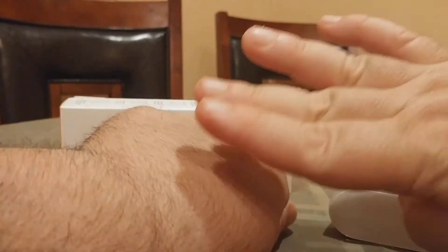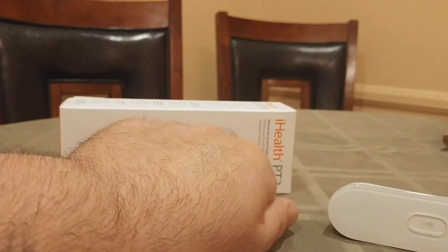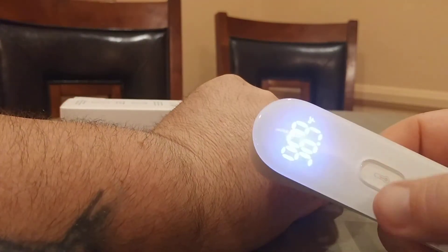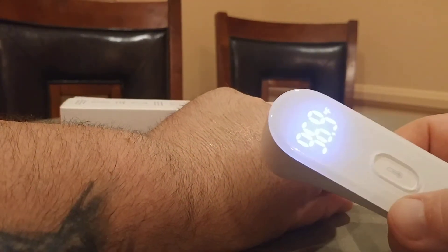Let's do it one more time. If I lick the back of my hand — as you can see it glistening right there — and I try to take a temperature, you get 96.9. So it's definitely inaccurate.